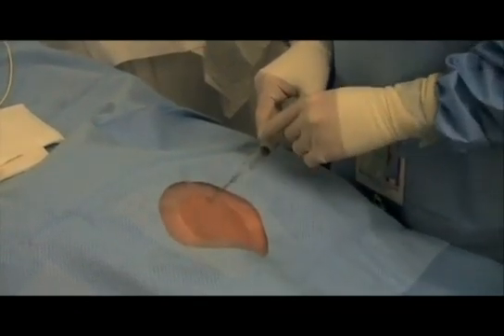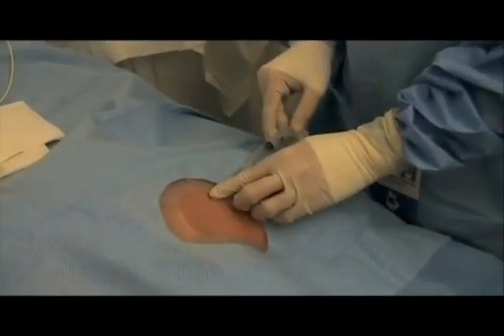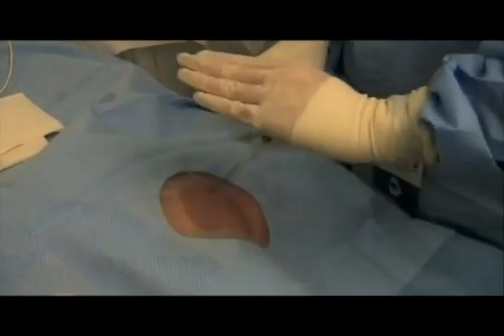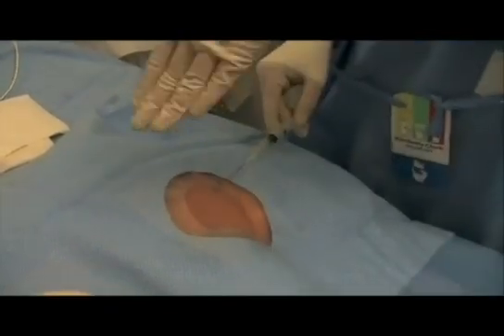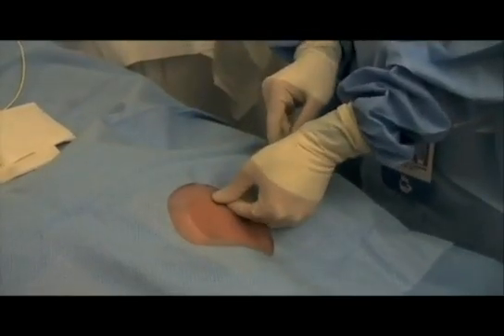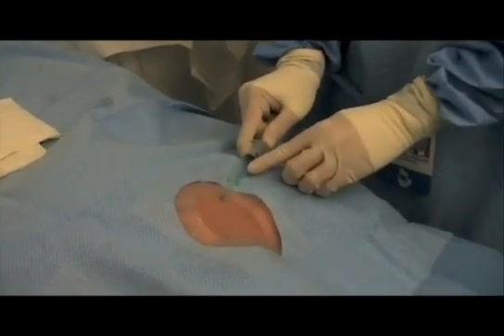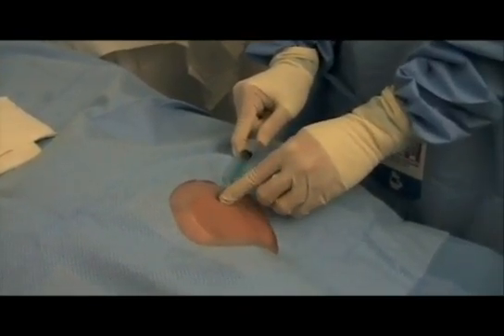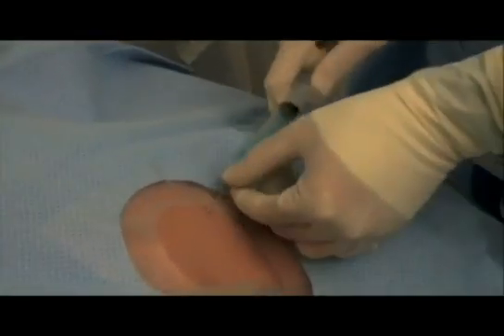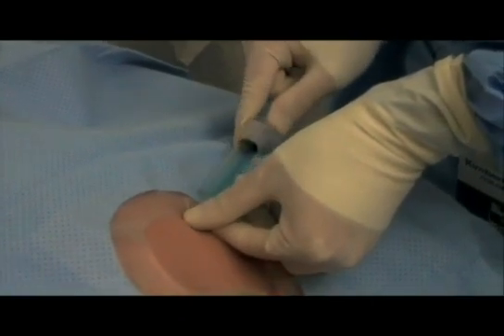If I'm hitting bone directly parallel to the ground, you might ask how I'm ever going to get underneath that bone. The way you do it is: I'll actually push the whole needle and lower my syringe. So instead of raising the back, I'm pushing the whole thing down — I'm staying parallel to the ground but I've just pushed the whole thing down. And we hit flash right as we are at the hub of the needle, and that's not uncommon. We never moved off the parallel — staying parallel the whole time — and we get our flash right there. That is the key.